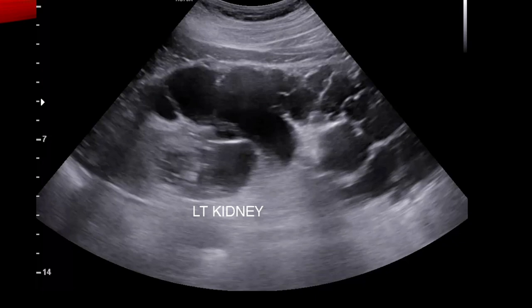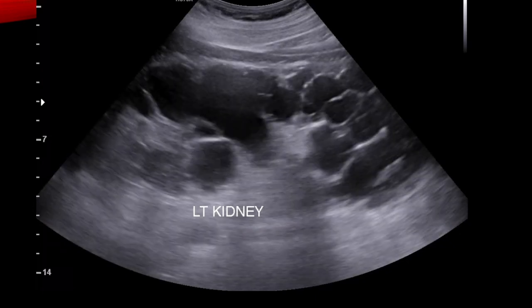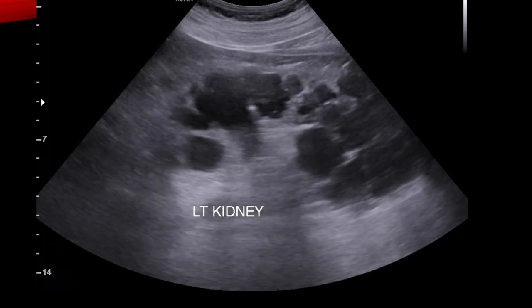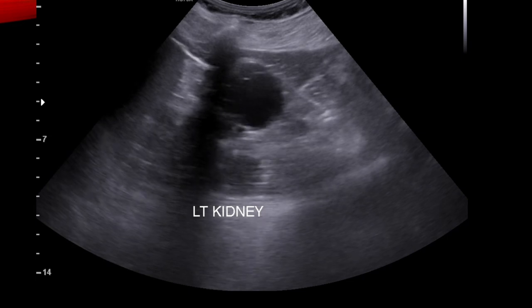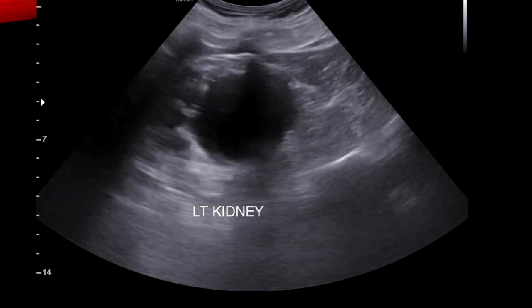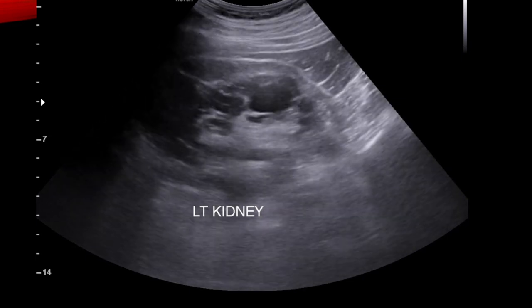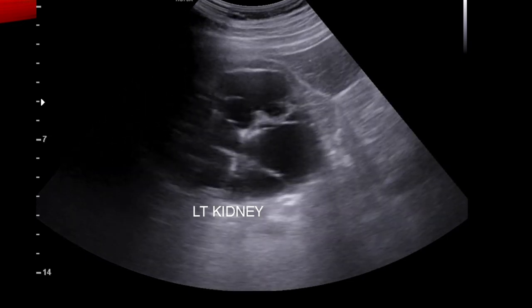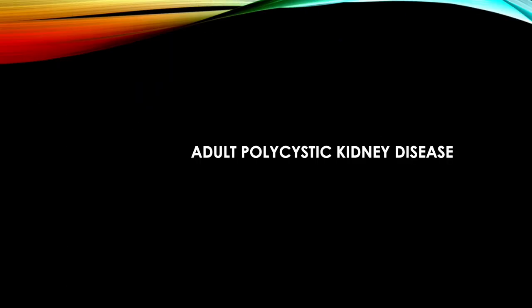Ultrasound examination revealed multiple large anechoic cysts with well-defined imperceptible walls showing posterior acoustic enhancement. Our diagnosis was adult polycystic kidney disease.